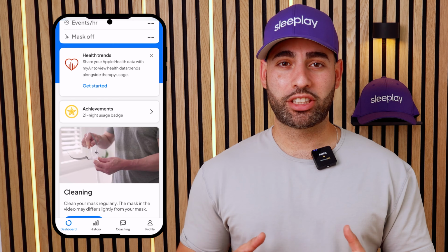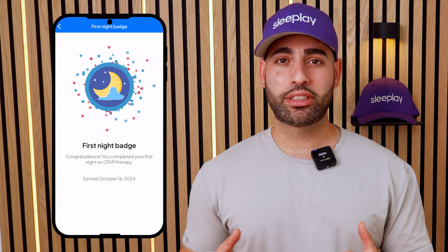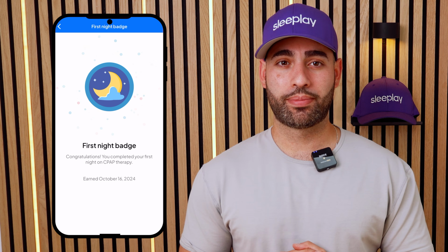Remember, you're not just collecting numbers, you're seeing progress. The app gives you the following. Badges for hitting milestones. A streak counter to keep momentum, and personalized encouragement based on your usage. It's small stuff that can actually help you stay consistent.